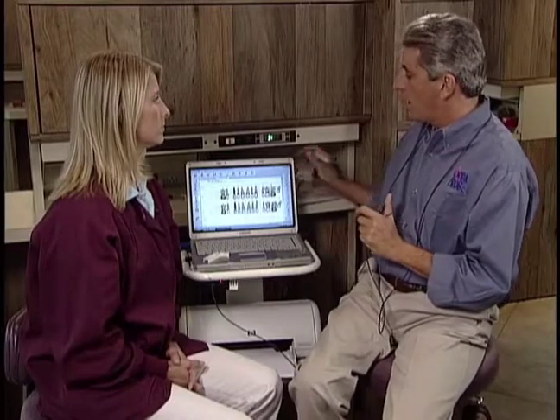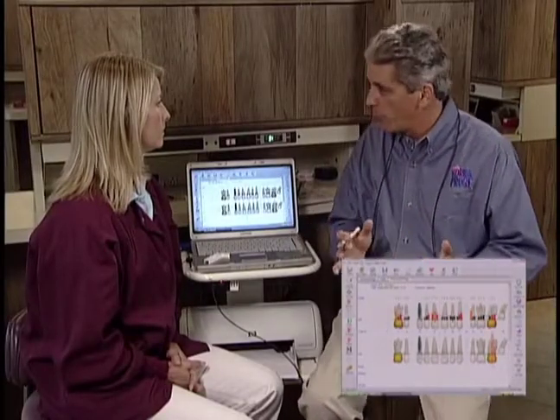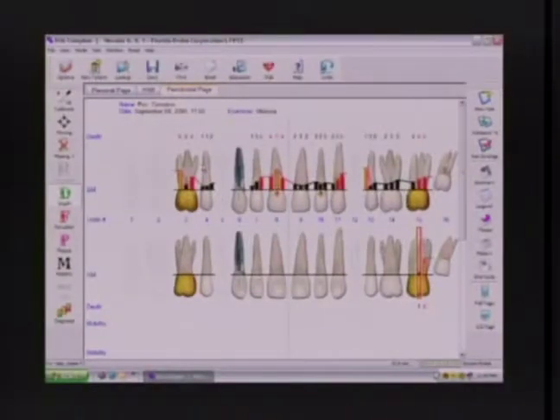The second common mistake is I'm probing a periodontally involved patient. Warning, 4. Warning, 4. Danger, 6. And all of a sudden I hear something like, 1. Is that possible? It is, but I want to reconfirm it. So I simply undo and reprobe that site.